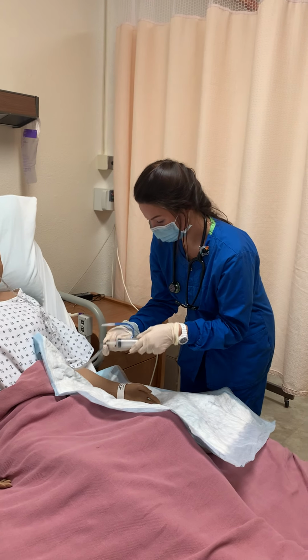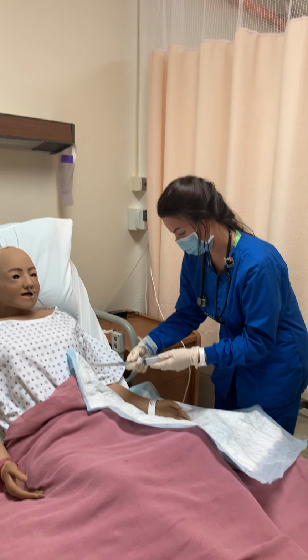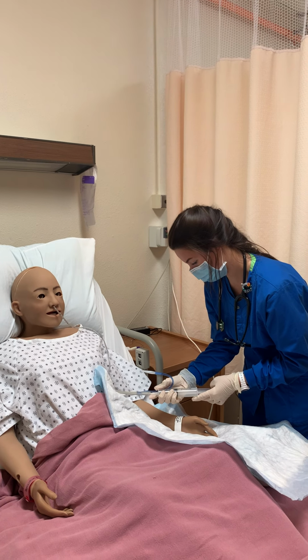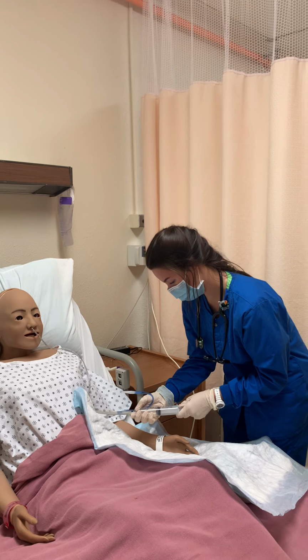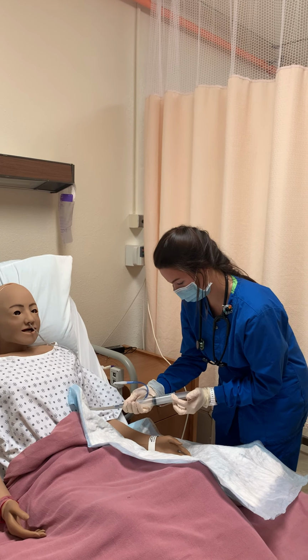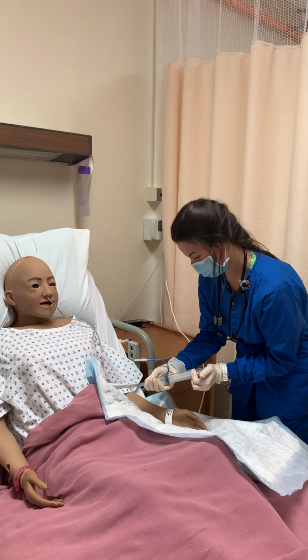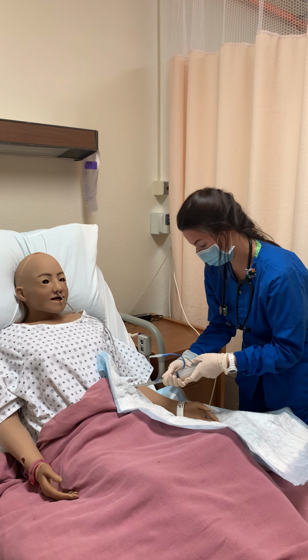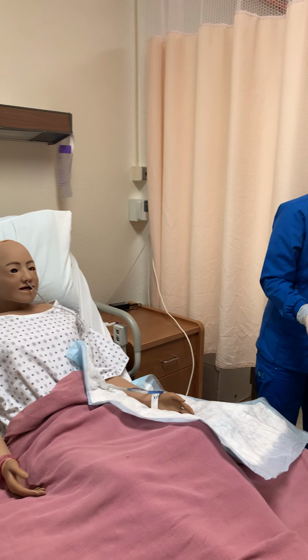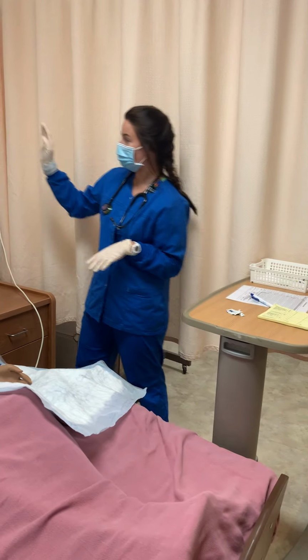So I'm just going to undo her tube here. Okay, so Joanne only has 35, so we're good to go. So I'm just going to go ahead and push that back in. Okay, close off the end. Okay, and then I would put my Jevity into my bag here.